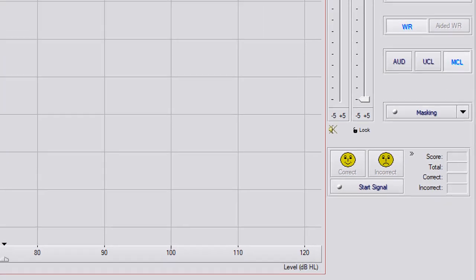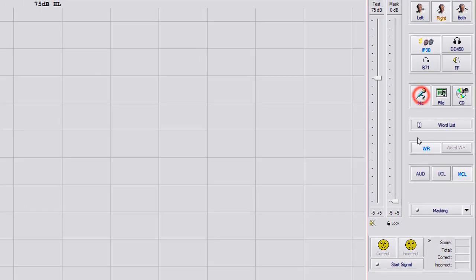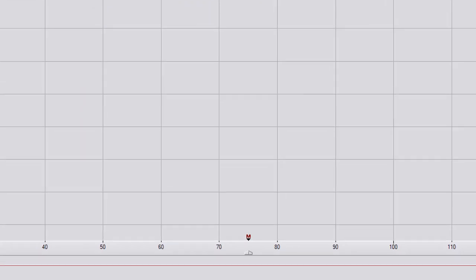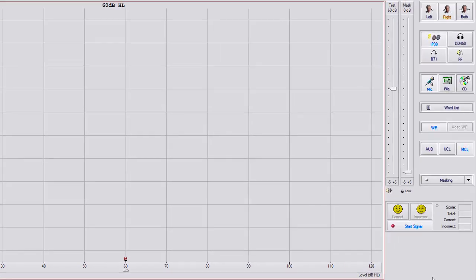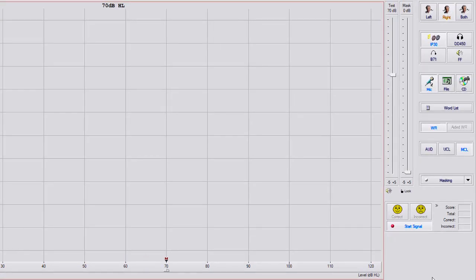Or what most providers do is they'll go to microphone and they'll hit start signal and they'll say, okay, Mr. Smith, let me know when my voice is most comfortable for you. And if you can see at the bottom of the screen, there is a red M that has popped up now when I'm changing the dB level. So you can have them raise their hand or just say, okay, that's most comfortable for me in the right ear.